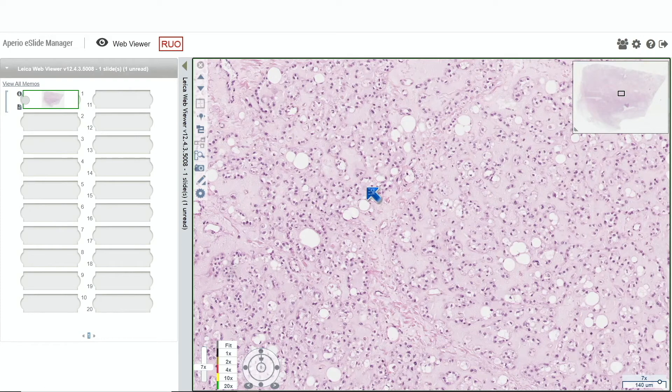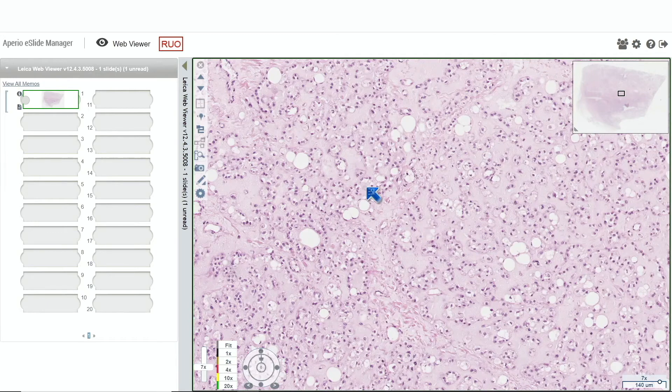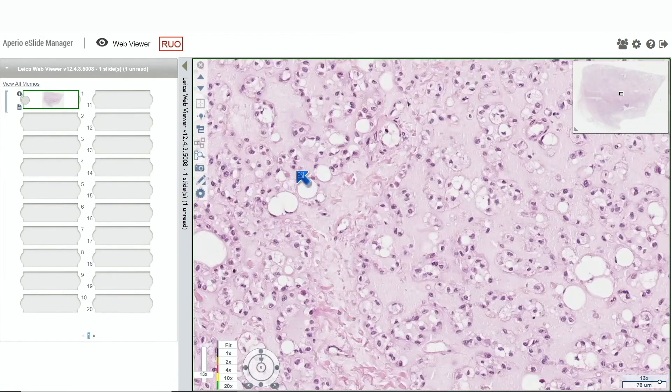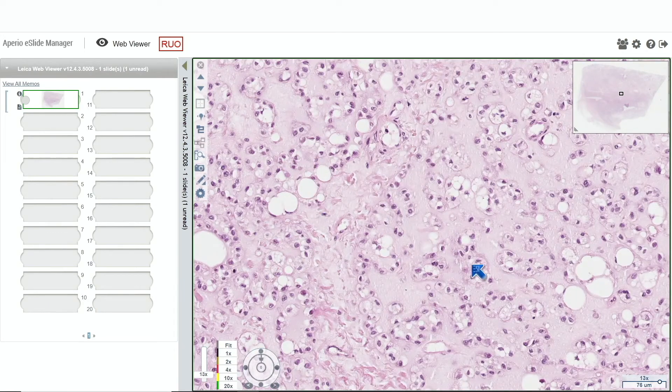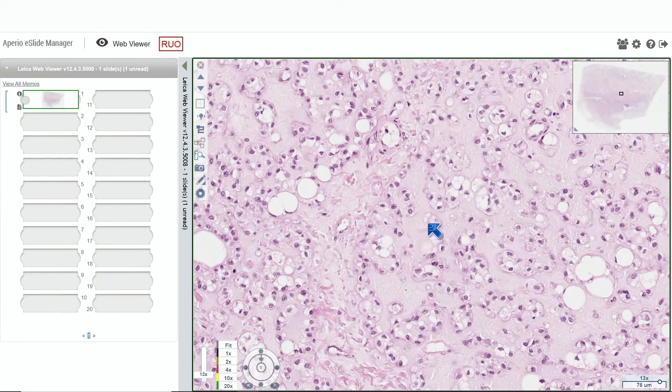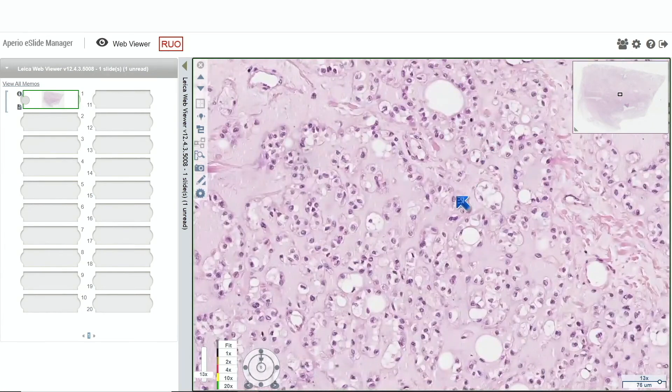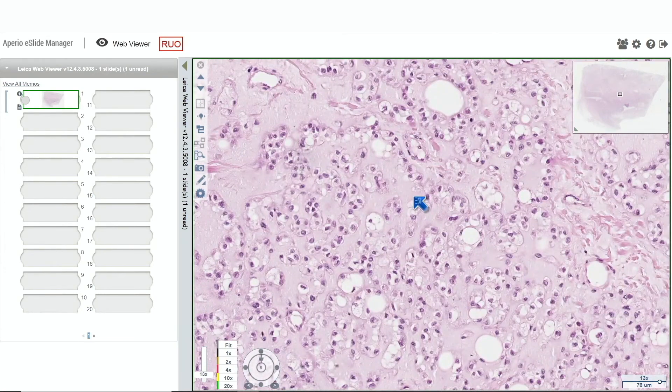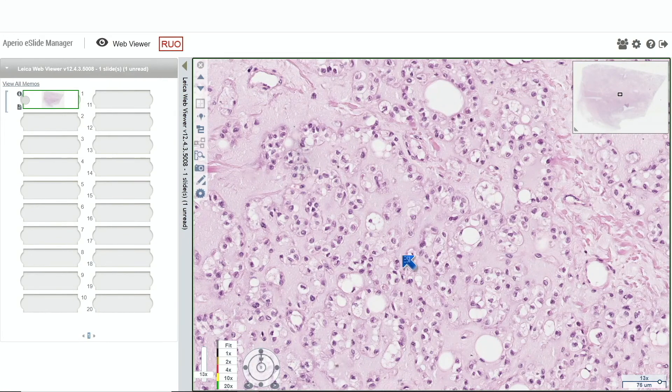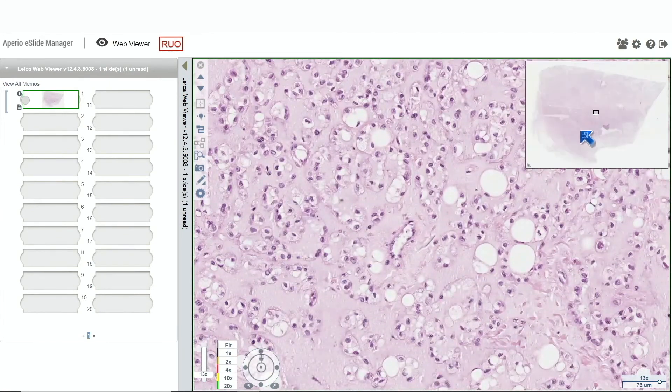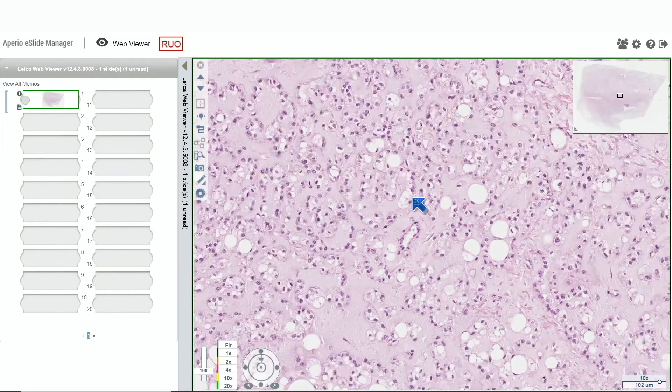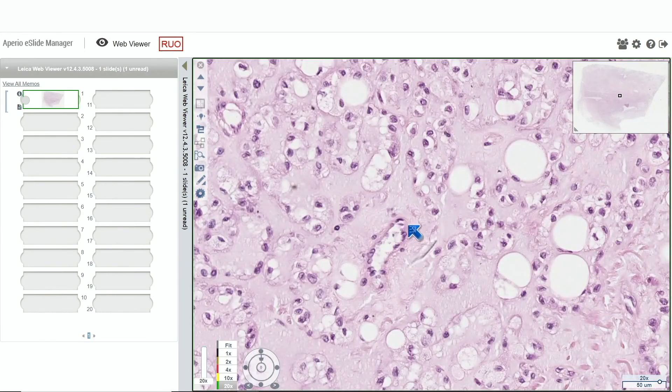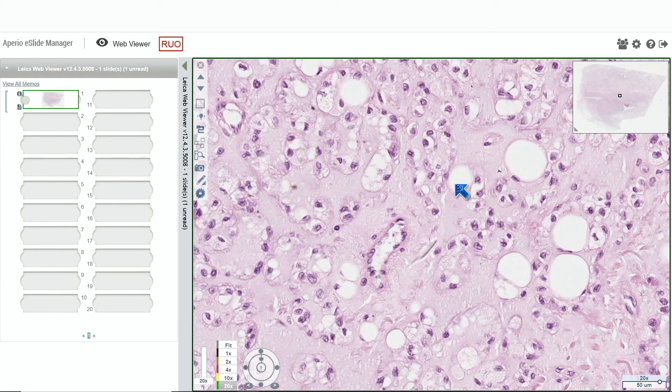When you see a real one, it's kind of nice. This is a real one where you have this admixture of fat and these epithelioid cells that are deposited in this myxochondroid-looking stroma. It's not like a well-differentiated fatty tumor with little areas of metaplastic cartilage—it's totally different. It tends to be a superficial, well-circumscribed lesion, but it's pretty uncommon. I have to say I've only seen a handful of these.